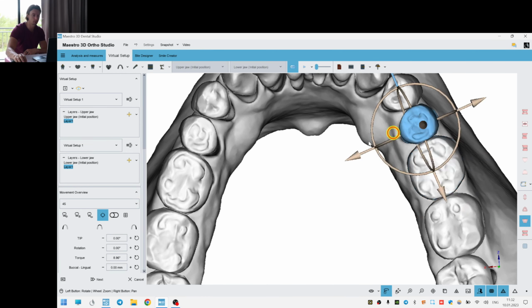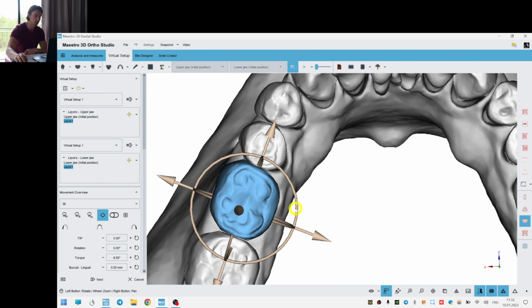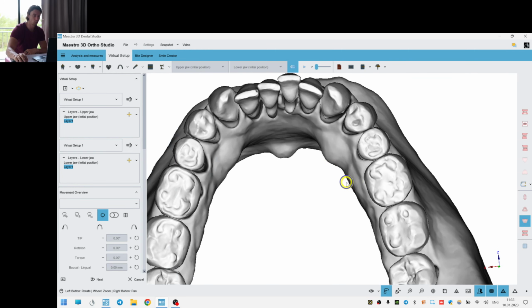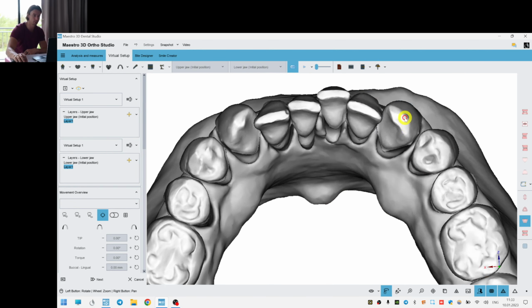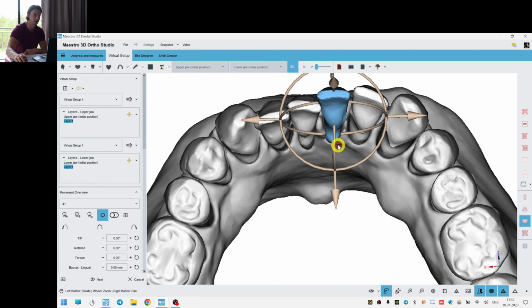So once we expand, we start to see some gaps, and we can close them with a couple of instruments. The first is rotation, and the second is distalization. But we cannot distalize more than 2 teeth on each side simultaneously, so we need to divide those movements to a few layers if we want to distalize more than 2 teeth on each side at the same time.